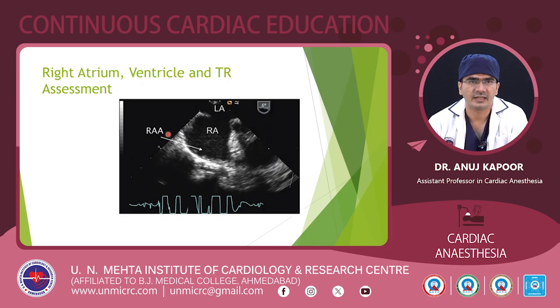Now we will assess the right atrium, the right ventricle, and the tricuspid valve. On the four-chamber view, we will get the size of the RA, and if it is very dilated, it indicates that it is a long-standing ASD and it has caused chamber dilatation, which in the post-operative period will be important, because after closing the ASD, the right ventricle can trouble us, and it may require support.